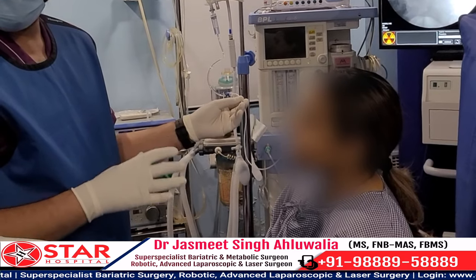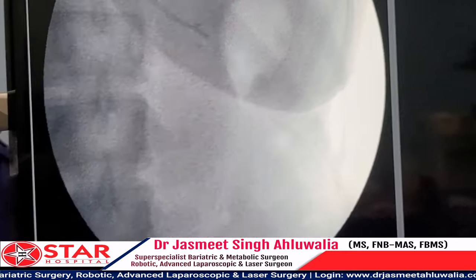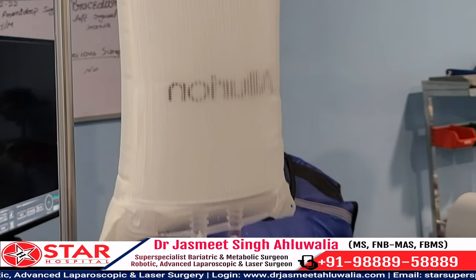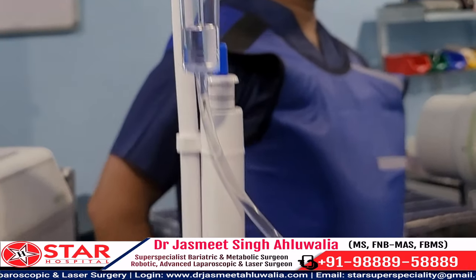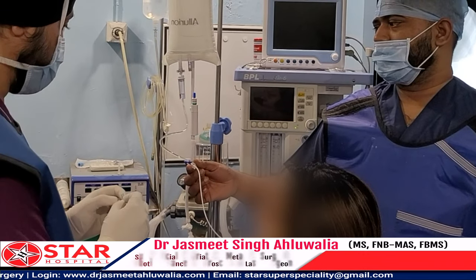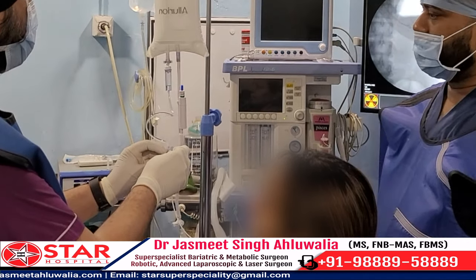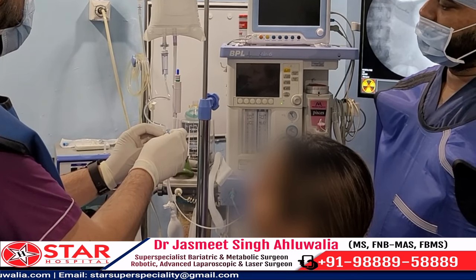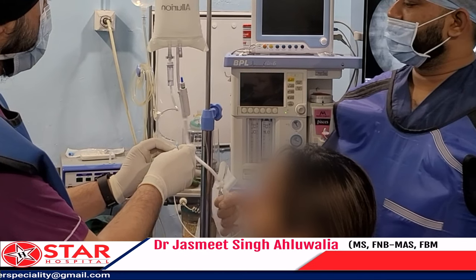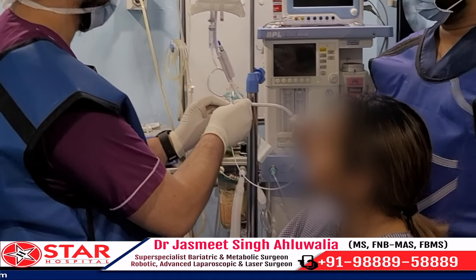This is a close-up shot of the catheter taken before inflating the balloon. You can now see a free flow of fluid entering the balloon. As the fluid level goes down in the bag, it starts filling even more rapidly. Since the pressure inside the bag decreases as the fluid escapes, we keep increasing the pressure so that optimum pressure is maintained.